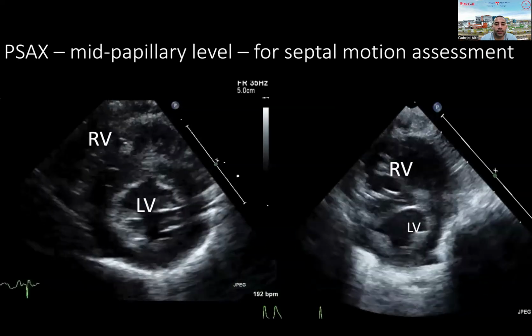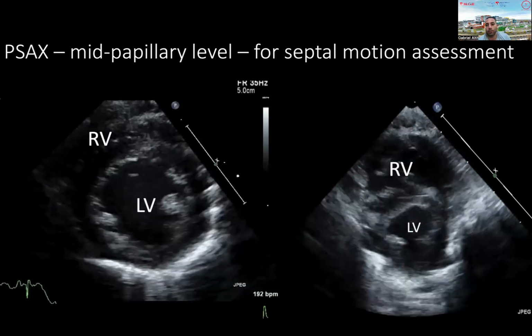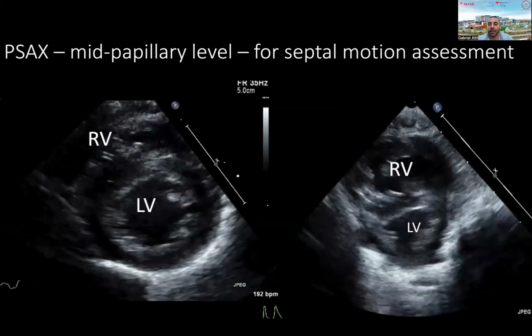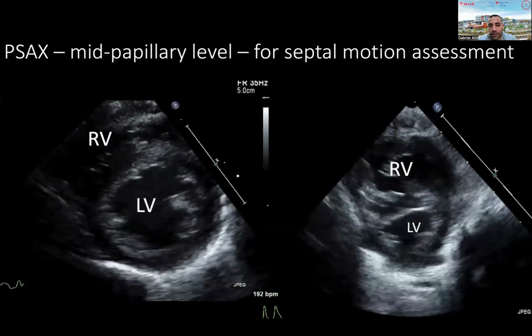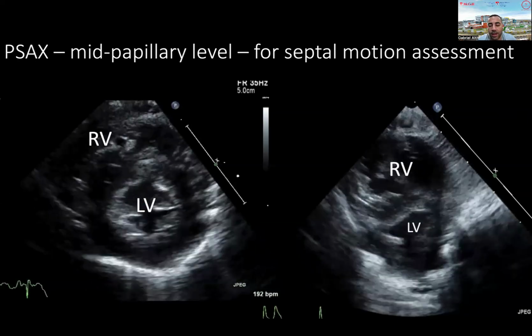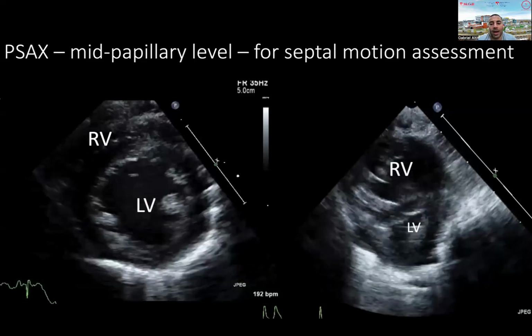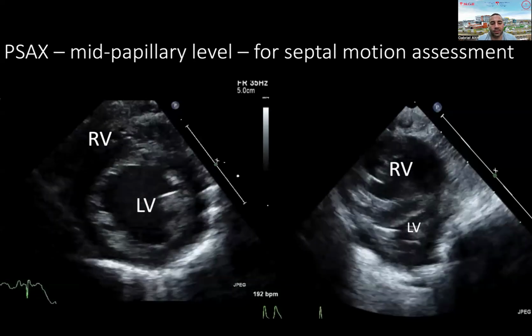And the LV is connected to the aorta and the aortic valve is open at the peak of systole, which means that the RV should represent the PA pressure in systole and the LV should represent the aortic pressure in systole. And obviously it's not exactly the same story in diastole because at that point it represents end diastolic pressure when the pulmonary valve and aortic valve are theoretically closed. Unless you have significant pulmonary insufficiency or aortic insufficiency.